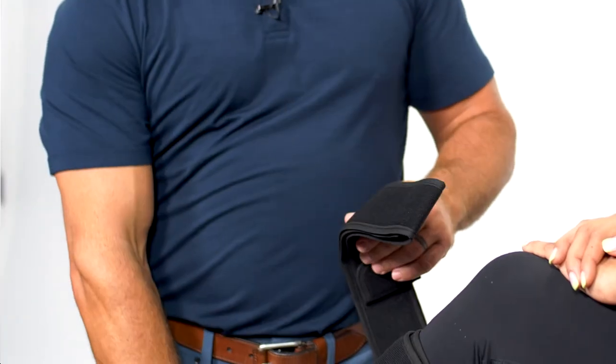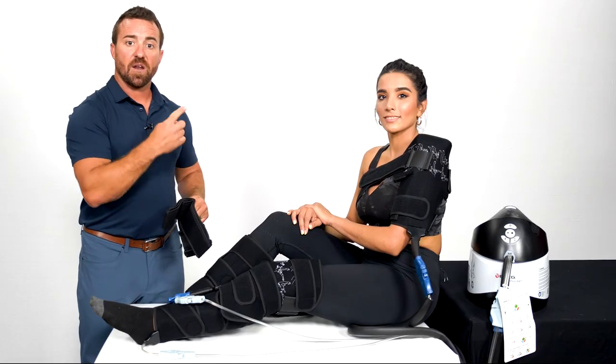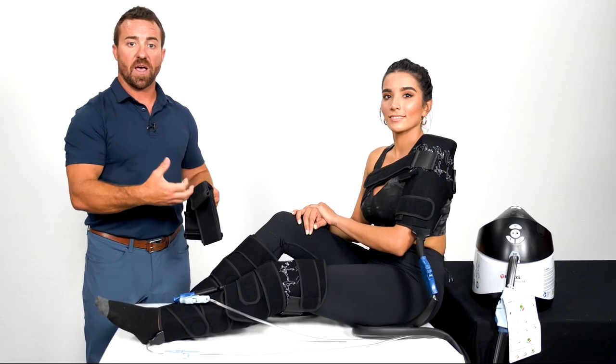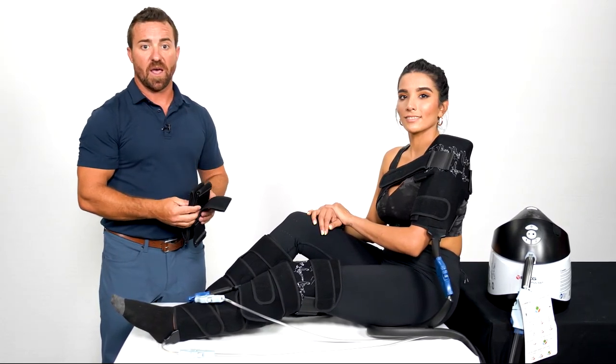For the knee, we're going to use one of our long narrow straps, velcro to the pad, and wrap around the knee to secure the pad. If you need to secure it further, there are extra straps to further secure the knee pad.